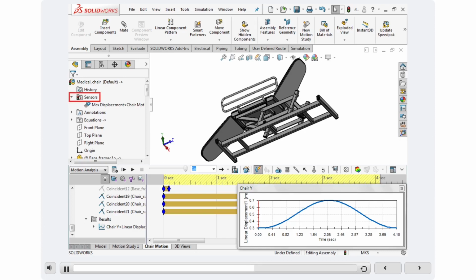Similarly, we will create a sensor for minimum displacement. We have created the sensor named Min Displacement for the minimum displacement. The goal of the optimization analysis will be to minimize the force required by the motor while ensuring the chair raises up high enough and comes down low enough. Sensors have already been created to monitor the height of the chair. We will create one more sensor to monitor the force of the motor.